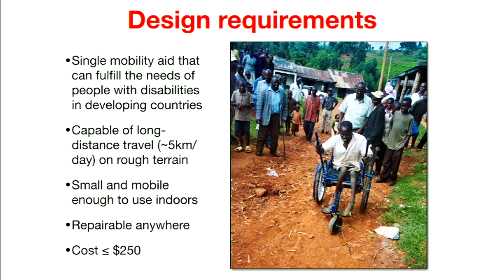But at this time, about 10 years ago now, a little more than 10 years ago, the other wheelchairs that would be used in a developing world setting that would actually provide a user a good experience, not like a really crappy hospital chair that might break in a condition like that in a few days, but a more rugged chair, the price point was around $300, and we wanted to beat that price point or be around it, and that's why we set that design requirement.